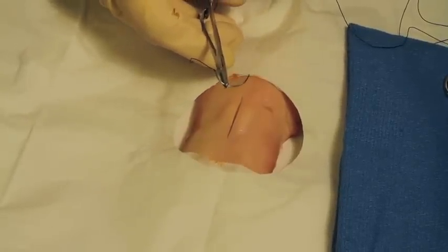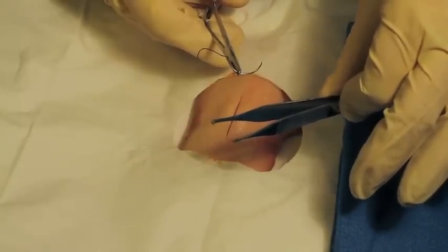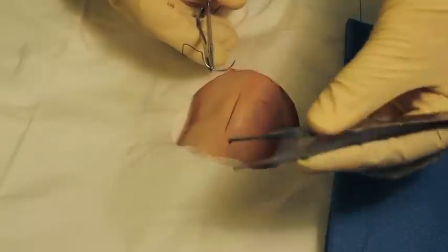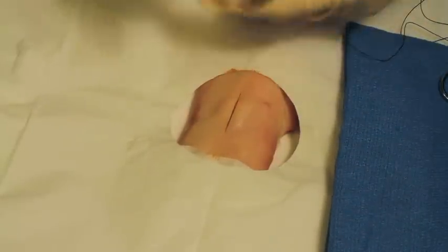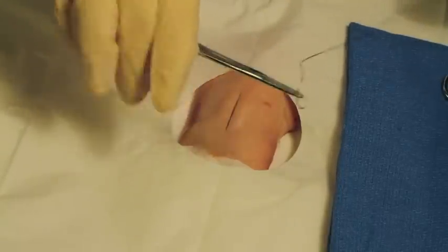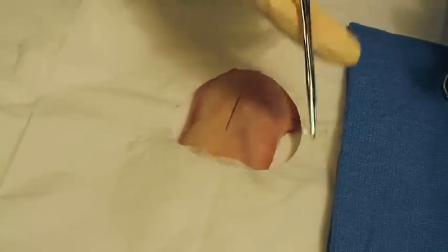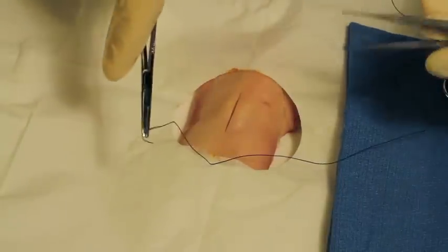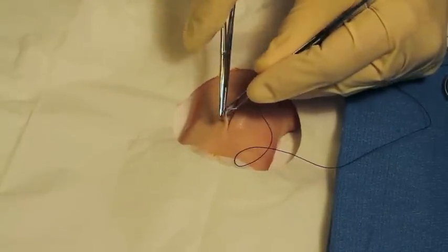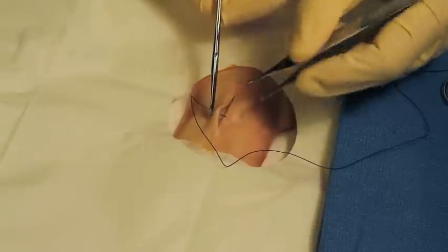Grab your forceps — the forceps are basically like a set of tweezers — and they're used to pick up the skin and hold it in place while you're driving the needle through the skin, in this case the pig's foot. Grasp the needle holder just like I'm grabbing it. You can see how I'm grabbing it there, and you're going to work it with a twist of the wrist, just like that. Repeat that every time — grasp the skin, lift it, and have your needle at a 90-degree angle to the skin, and push right on through. Pigskin is a little tougher.